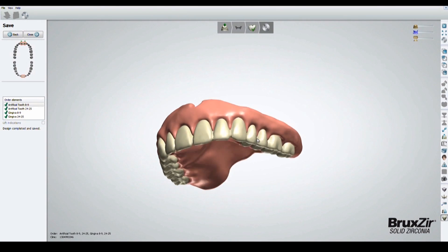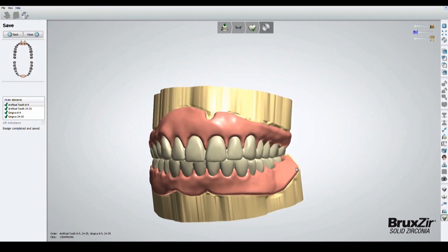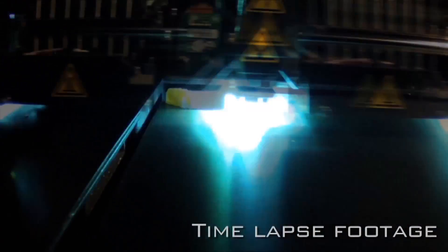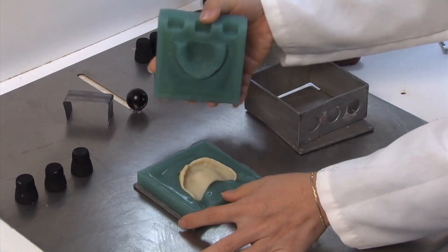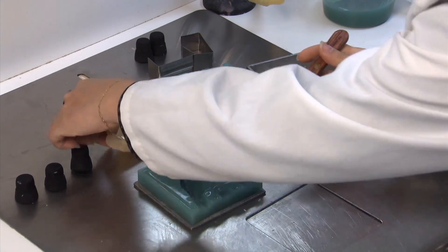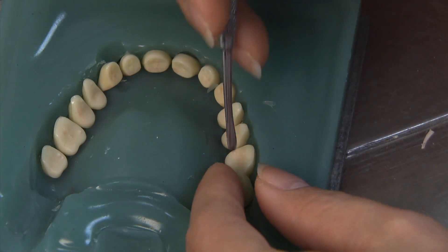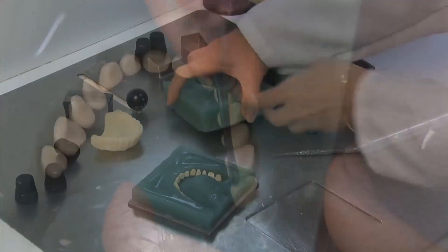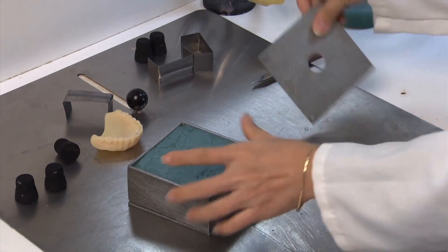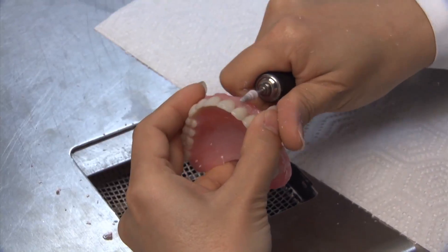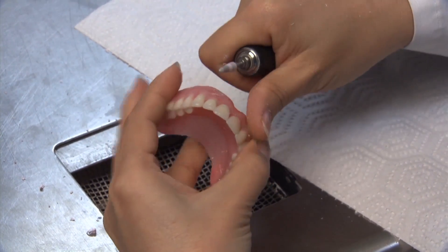At this point, we have a digital file to utilize for fabrication of the final denture. We print the extracted denture-less arch — both arches — and also print a denture, so the denture can be processed based on what the denture-less arch looks like. Once we have the negative of the denture and the duplicate is taken out of the mold, we place the acrylic in its place and proceed with processing. An alternate method is to have the denture milled with acrylic material, so if you want to go completely digital with no analog work, the entire denture can be printed.